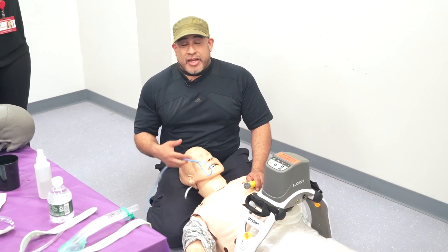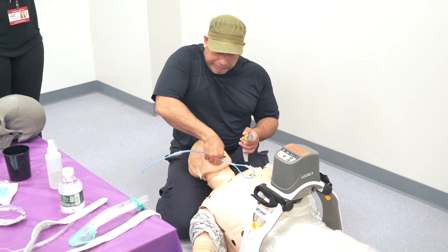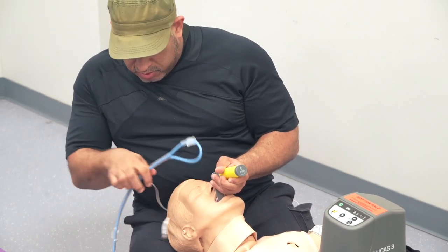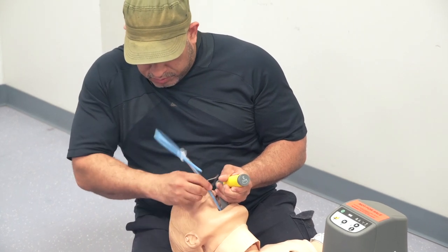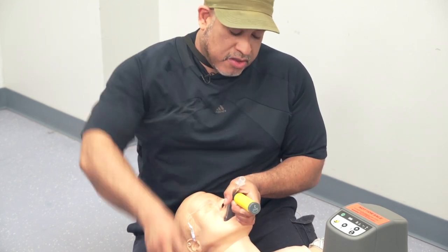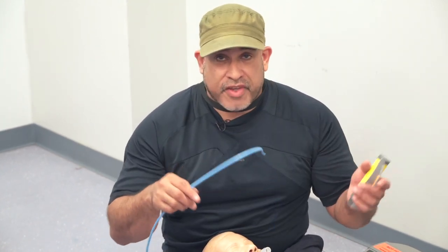So as close and intimate as I am to this patient, you'd open the mouth. Oops. I have to lean back. Get the tube in. Thumb also to confirm that it stays secure. Pull out the bougie and it's in. Now everyone likes this technique because you have to be very close and intimate to a messy patient. So that's the last part of phase two.